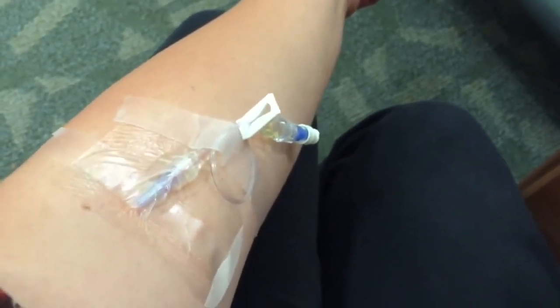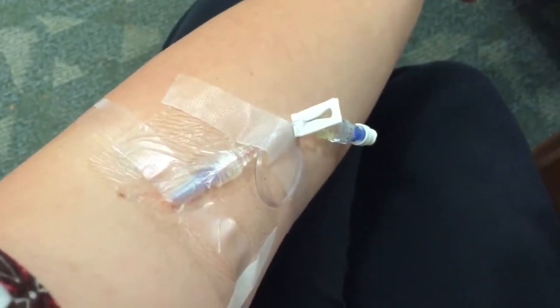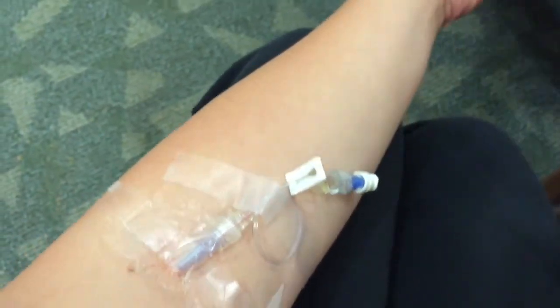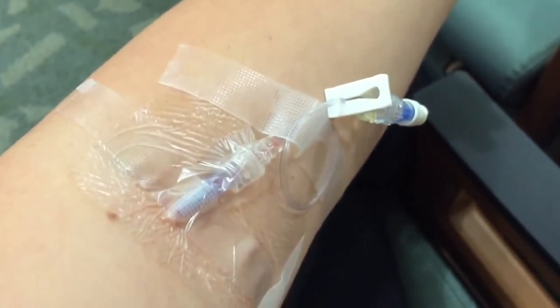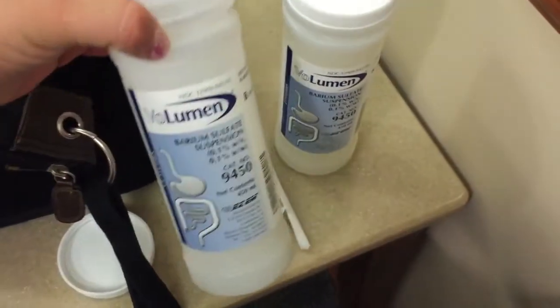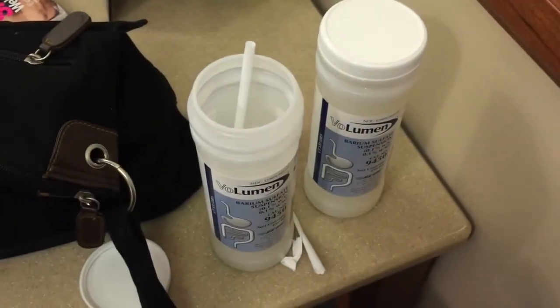I'm here at the hospital getting an MRI done with contrast and just wanted to show the process. I checked in, did all the paperwork, and answered a list of questions — including whether I have any metal in me or piercings. They put an IV in me, flushed it with saline — I actually tasted it, no big deal. Now over the next half hour I have to drink these two bottles, spacing them out over 15 minutes each.